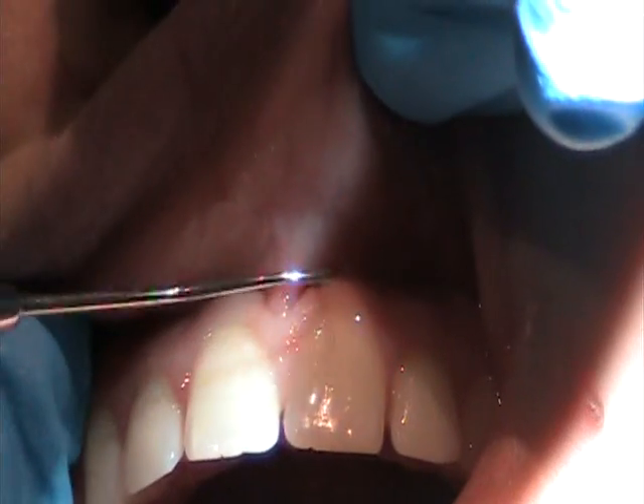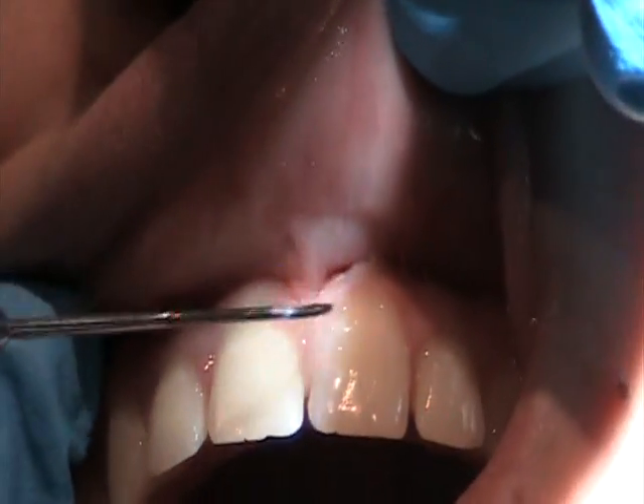Okay, a little pressure, right? You okay? Mm-hmm. And over here too?